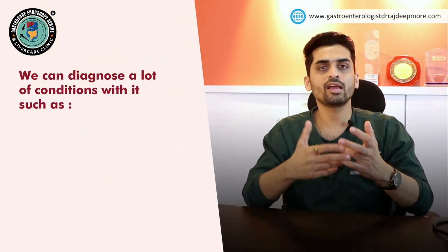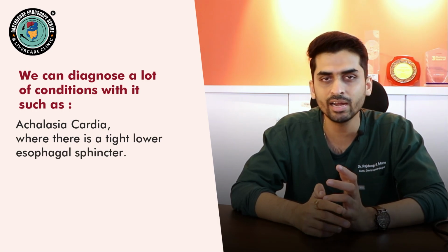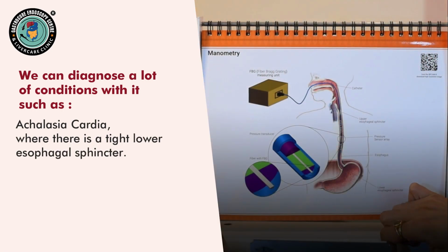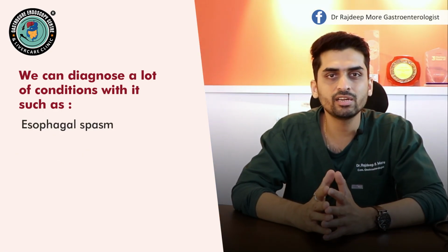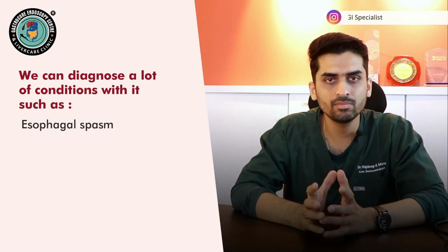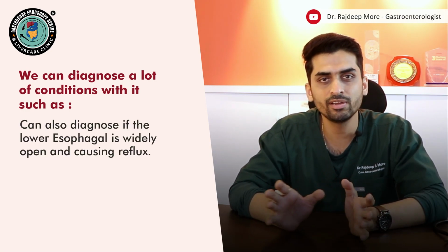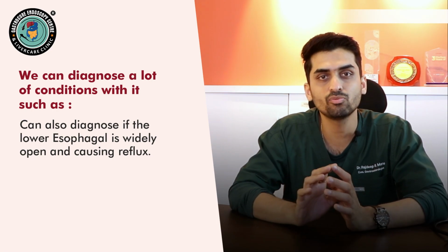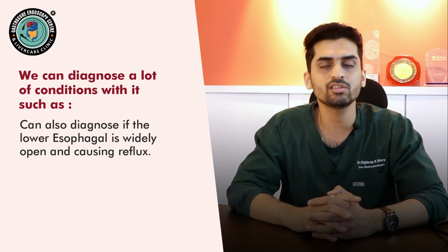Based on that, we can diagnose a lot of conditions such as achalasia cardia, where there is a tight lower esophageal sphincter. We can also diagnose conditions like esophageal spasm. We can also know whether the lower esophageal sphincter is widely open and causing reflux. So these are all the conditions that we understand from manometry.